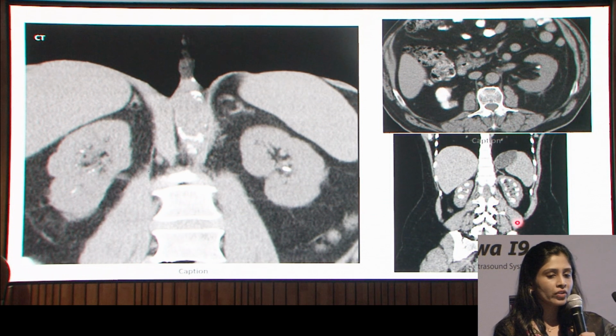In this image, what we find is a small shrunken kidney. It has a large ground glass-like calcification with paper thinning of the cortex. So with this kind of imaging, one should think of putty kidney, that is end-stage renal TB.